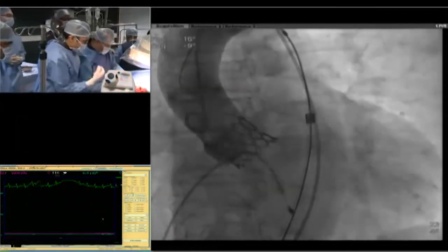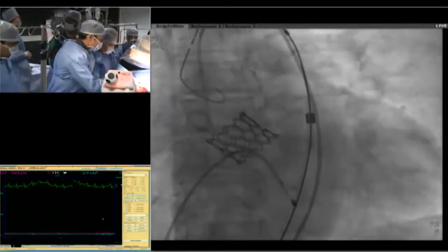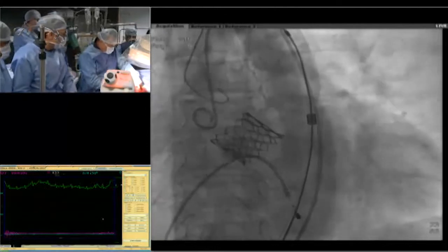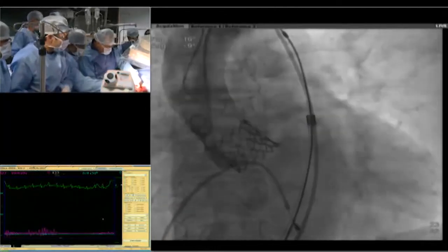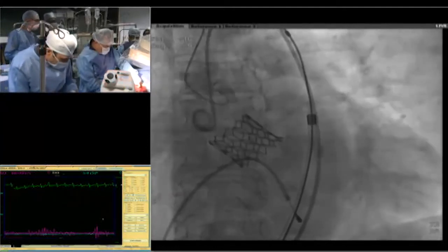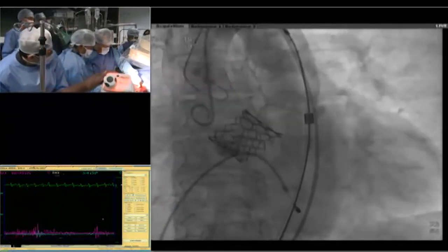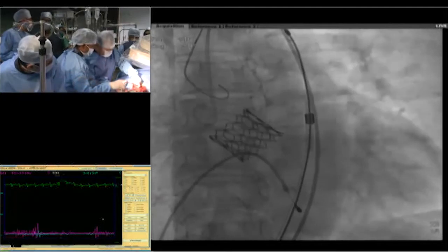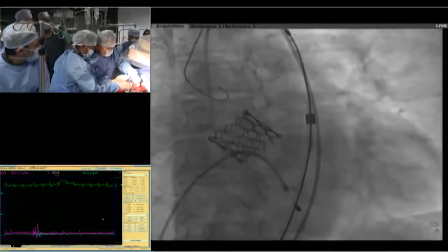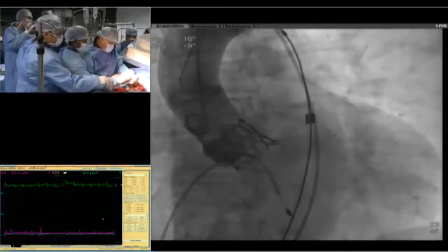I'll just pull up the ProGlide. So we'll just pull out the ProGlide a bit more. We'll remove this. You remove the whole thing. I think I'll leave the wire inside. Leave the wire inside. So what we're going to do is we're going to leave the wire. It's okay, it's inside. Don't worry. Just remove that. Oh, the wire also came out. Just take your time.